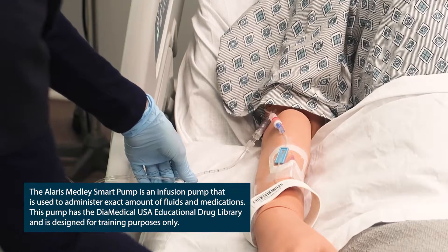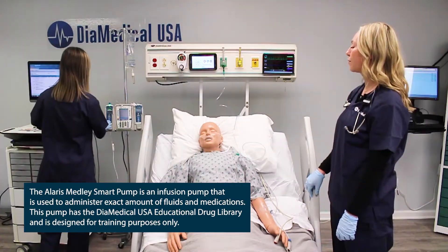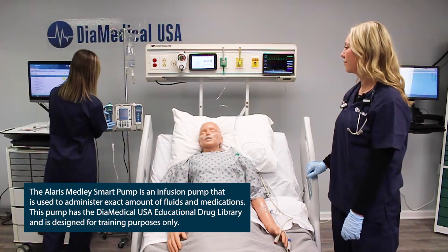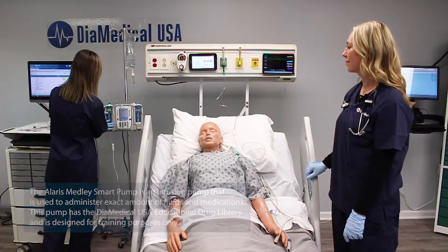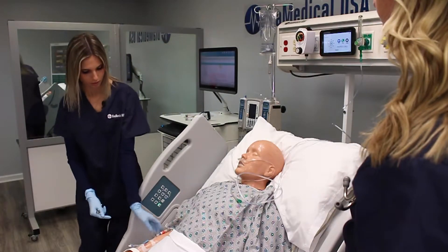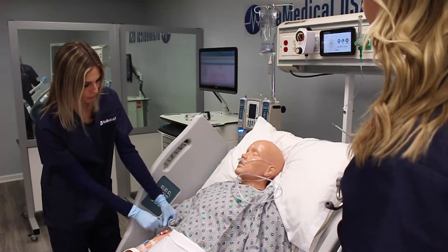Okay, turn off the IV and disconnect the tubing. She is fluid overloaded. I'll call the doctor to get the order.